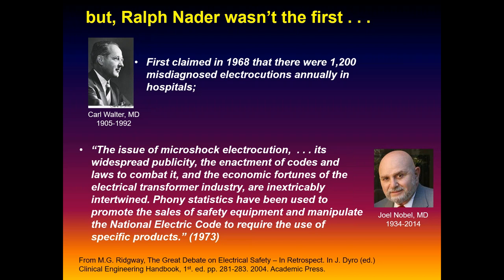In my first job, around 1975, it was still a Joint Commission requirement that every month we had to take conductive floor measurements in the OR. Remember they were doing that? And this was even though we weren't using flammable anesthetics, though they could have used them 15, 20 years before that. But it was in the requirement every month to go and do conductive floor testing.